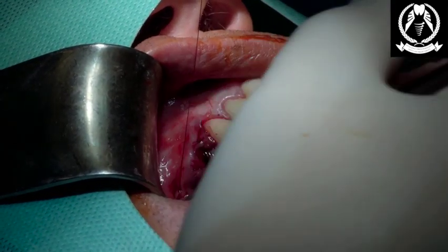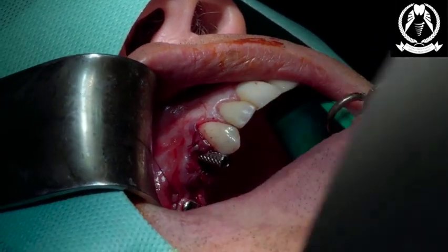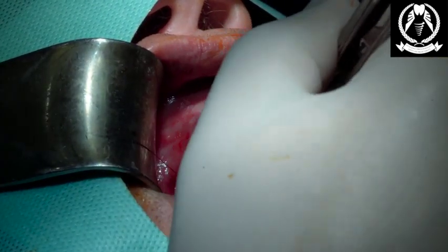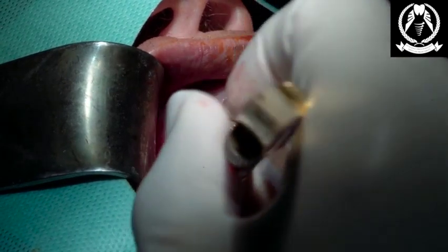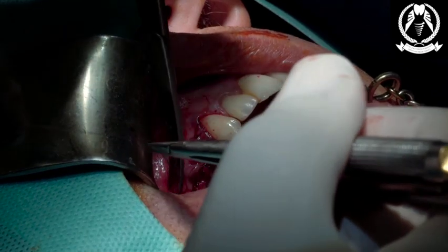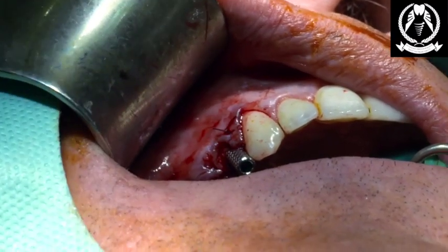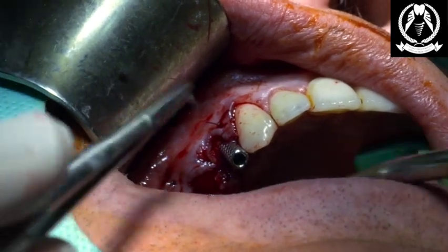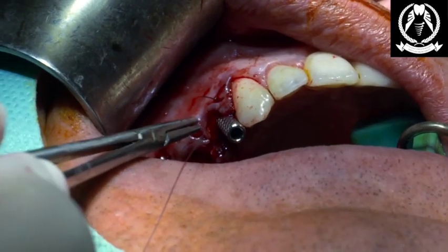How you doing, Alan? Still with me? Awesome. Sorry to disturb your sleep, sir. Pleasant dreams, sir. Great. Right. And one more little stitch. I'm just going in this way before I give Alan a little well-deserved break or snooze, whatever you want to do, buddy. Okay.